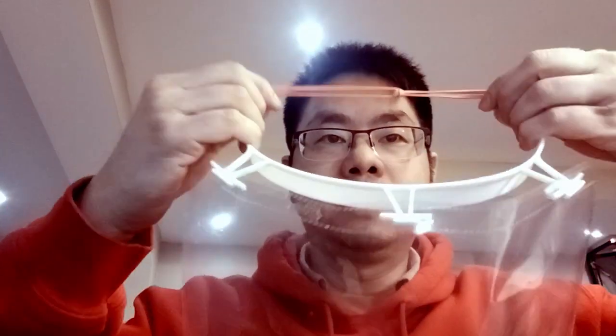You just slide it in like that. Same thing on the other side. Take the hook, there's the elastic, we'll just go ahead and snap it through. I like to put it on from the back first, slide it forward, center it up nicely, and then there you go.